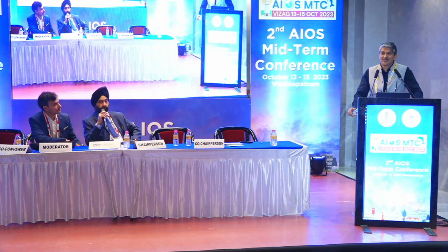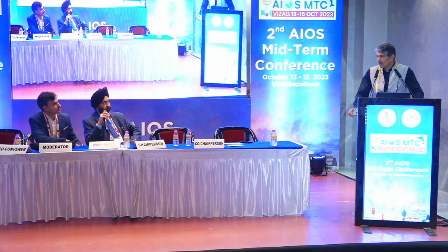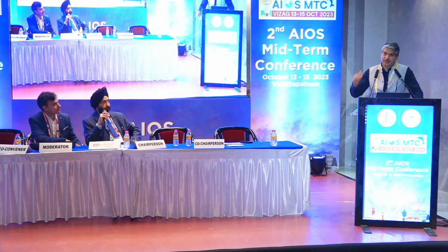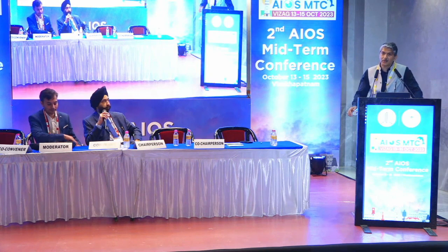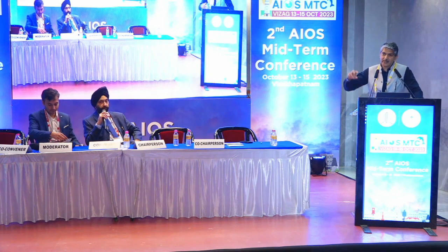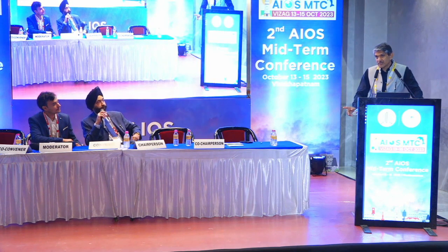Even with spectacle glasses, if you rotate your glasses, your vision is terrible. So you can have loss of best corrected vision, you can have poor quality of vision if your cylinder is not on axis. So we defined a technique, and I also have a SMILE marker which is available from Epsilon to mark the cornea and then compensate. We described this technique of rotating the cone on the 500, but with the 800 you can use the joystick, and then shortly you will have automated rotation. See, it is significant in about 8% of patients.